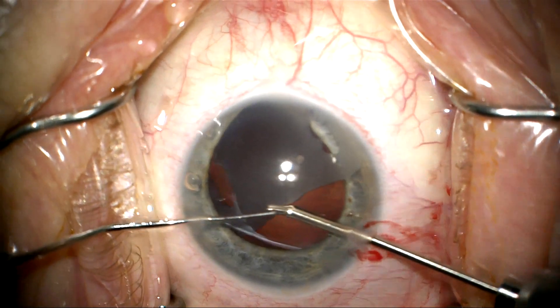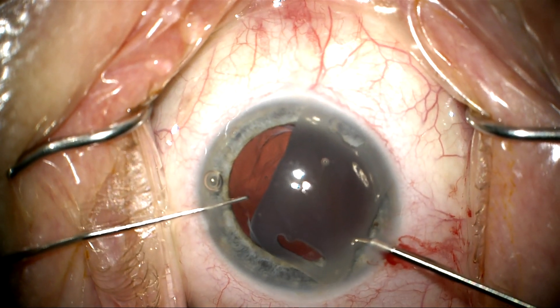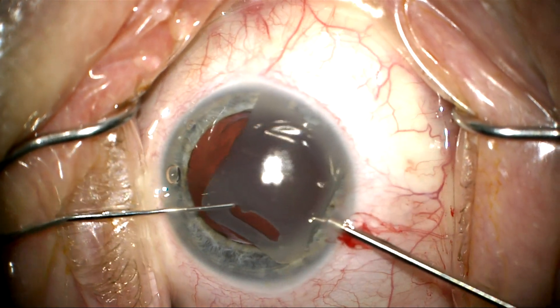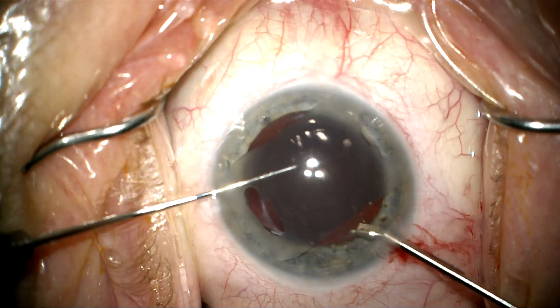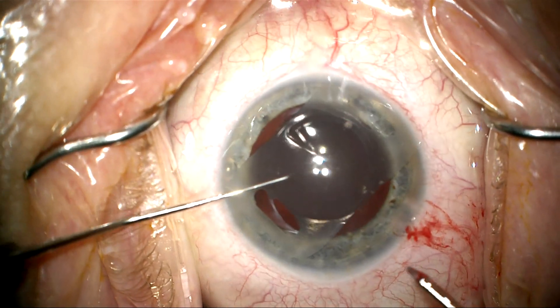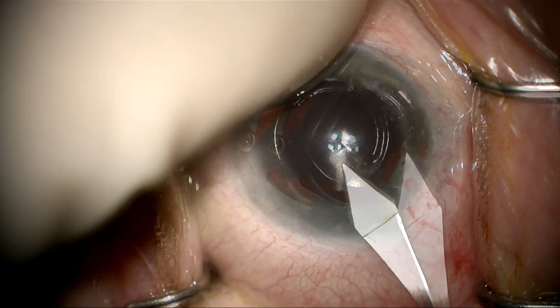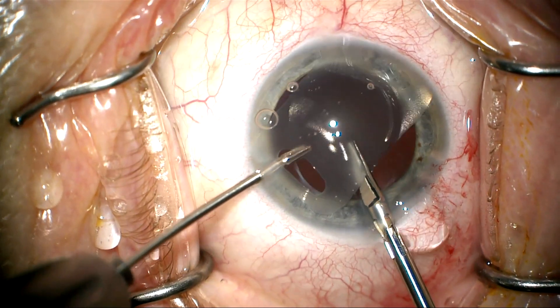Now we're removing the second haptic from the capsular bag, and again this comes out pretty nicely without too much fuss. Now that I've got the lens up in the anterior chamber, I've made a decision — I'm going to go through a clear corneal incision and cut this in half and pull it out through the small incision.